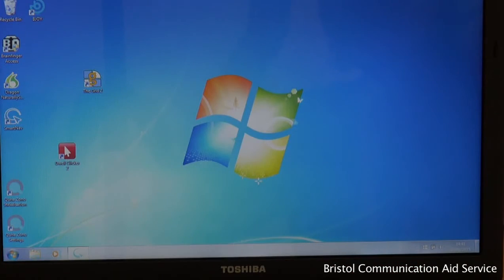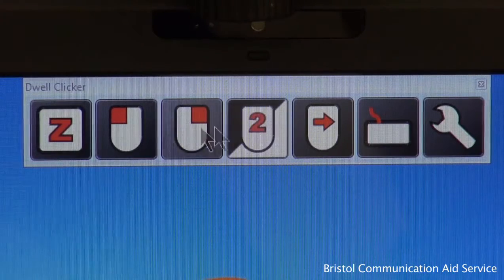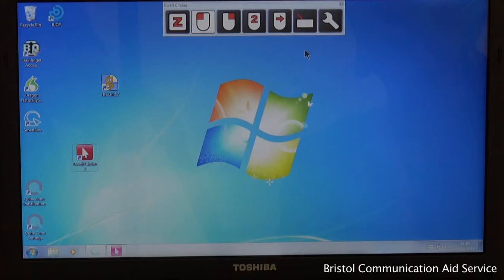Dwell Clicker 2 allows users greater independence to navigate usual computer functions via on-screen mouse options. Using the Smart Nav head mouse to hold the cursor over the symbols, selections such as left click, right click, and double click are enabled. Dwell Clicker can also be made to rest when not in use, drag items across the screen, or even access an on-screen keyboard.